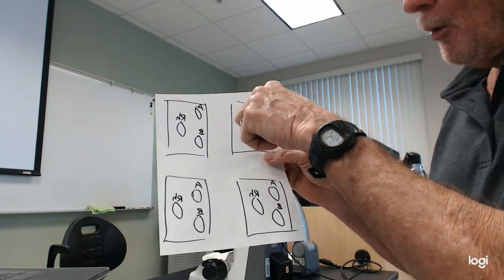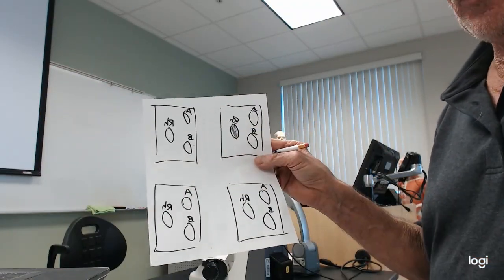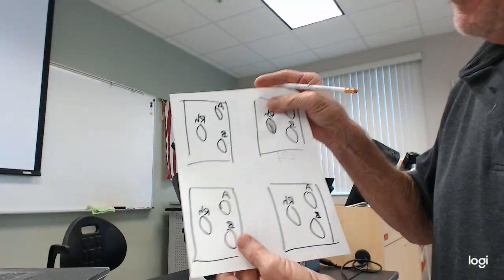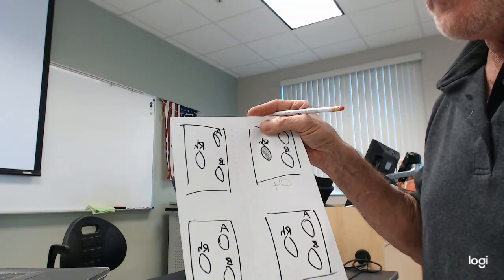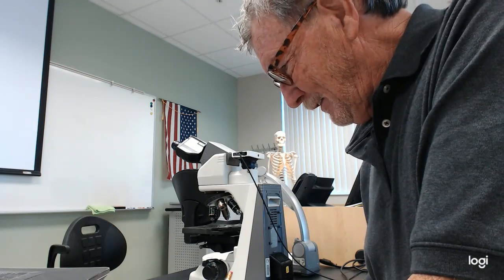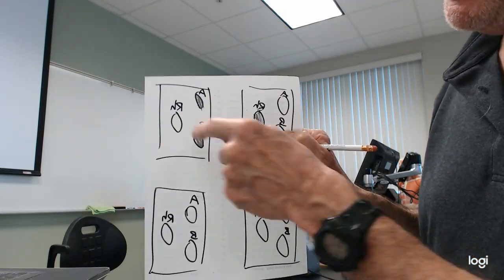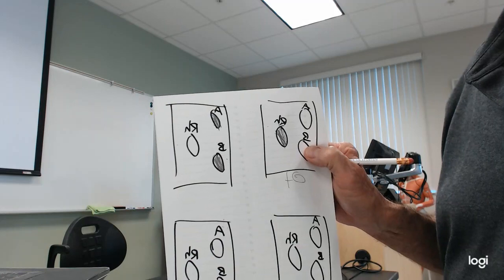That would be O positive, right? No A or B, but yes for the RH. That would be O positive. Okay? What if I put your blood in this one, 3 dots, put the 3 things in there, and it did this. That would be AB negative, right? Because the A and the B are both there, but the RH is not.